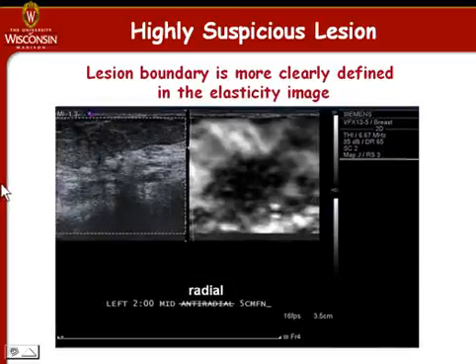planning. We see the same lesion in the perpendicular plane slid off the center of the lesion so that we don't see much evidence of the lesion in B-mode, but we see in the elasticity image that we're still in a region of stiffness that is abnormal.